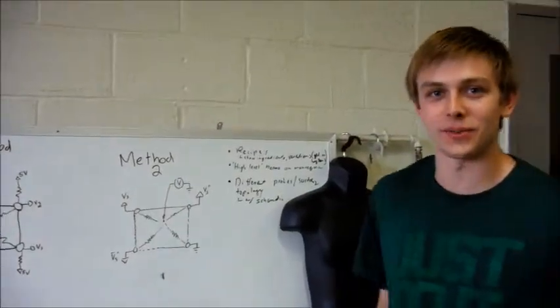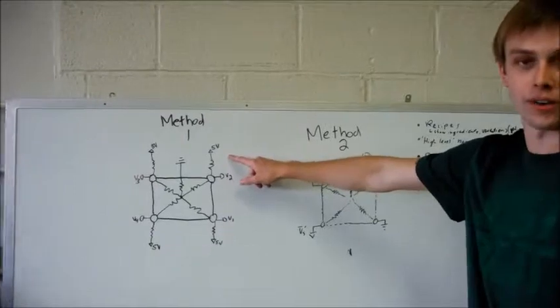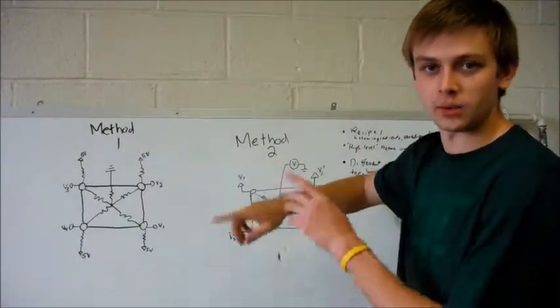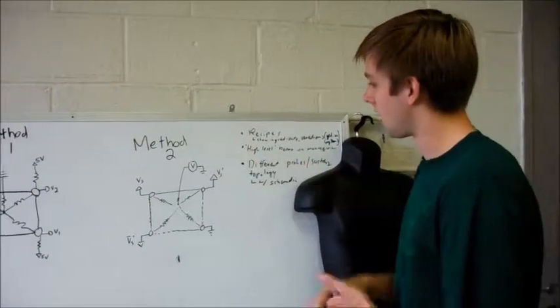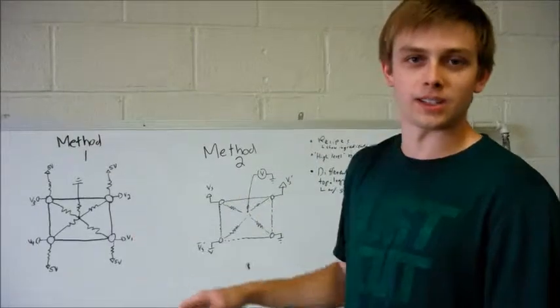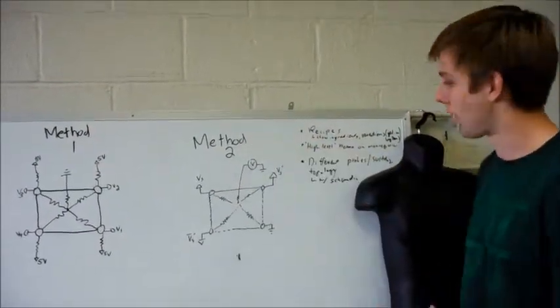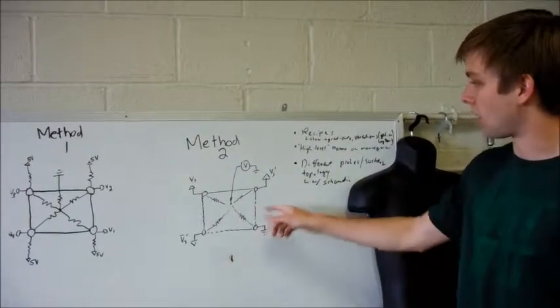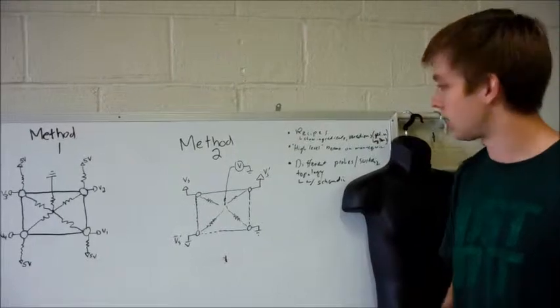So for the two different methods that we're using, we're trying to figure out the resistances by interpolating and doing voltage dividers, or method two, we're measuring a strict voltage. This method has proven to be a little more challenging and less consistent, so we have moved to method two as our primary goal to achieve, where we have the resistance built in with the material that we're using.